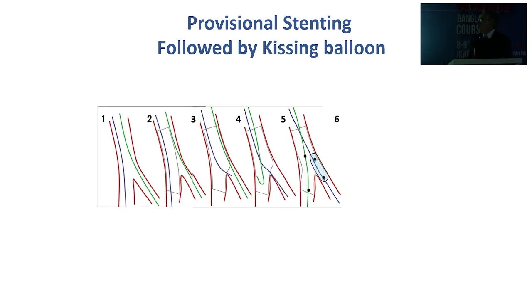This is another thing that we see a lot of people doing: they put a stent, crossover, all these things, and they just say, okay, let's open the struts to have access to the side branch. And you will hear that from probably your mentors. So they just put a little balloon in here, and they open the struts to get access. Again, here what happened: you didn't do kissing, so when you open the strut here, this part of the stent that was in here is shifted now to this side.